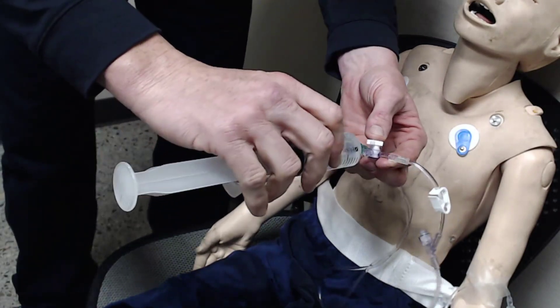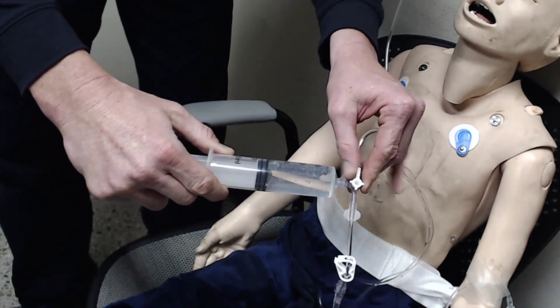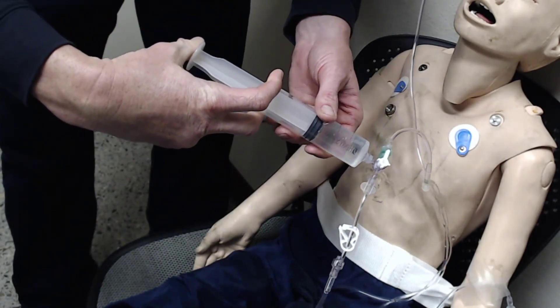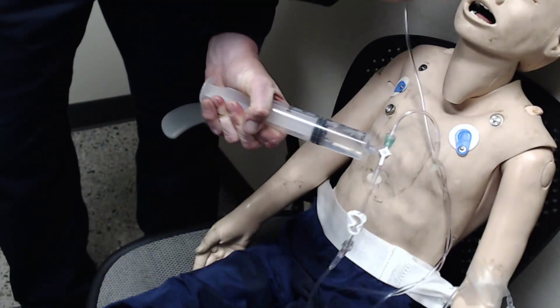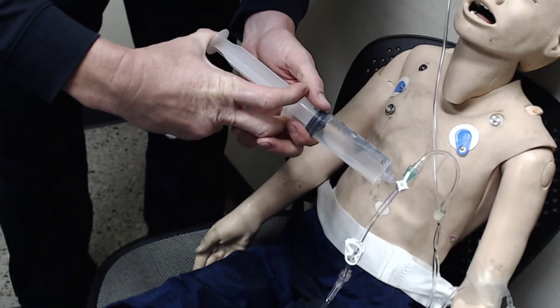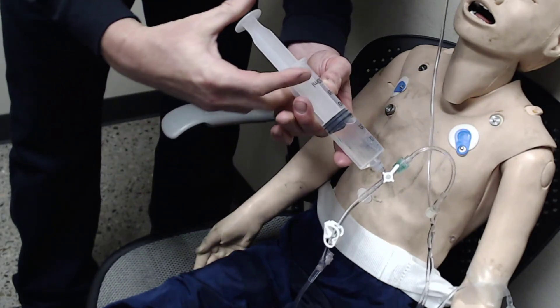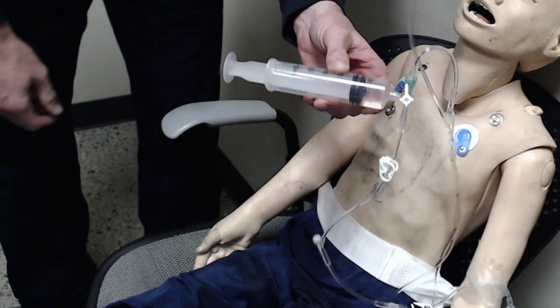Now grab your syringe and screw it into the open port. To give fluid, turn the stopcock so the longer portion — marked 'off' — is turned off to the bag. Open up your line and push to the patient. If you need to draw more, turn it off to the patient and draw from your IV bag, then turn off to the IV and push to the patient. This is pushing through an open 20-gauge IV catheter, so you can push quite a bit of volume pretty quickly. Hope you enjoy — have fun.